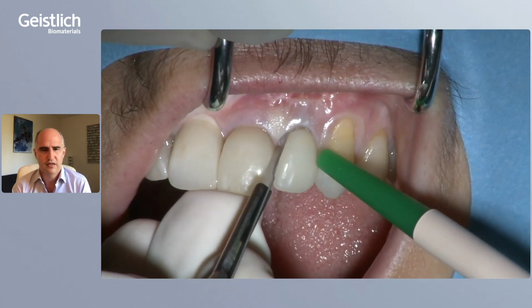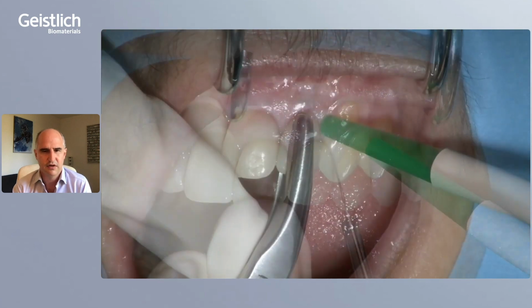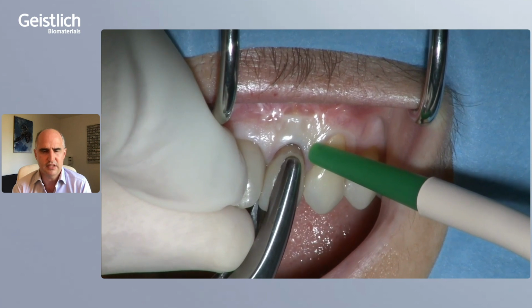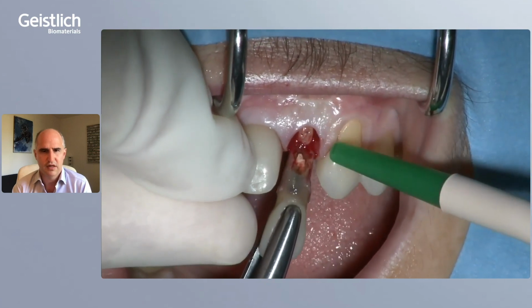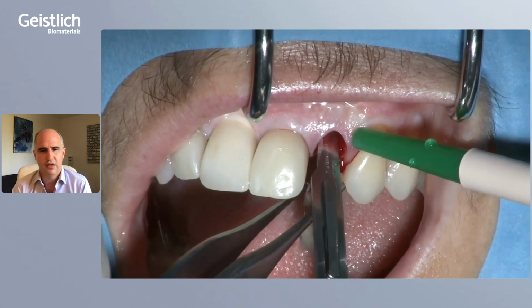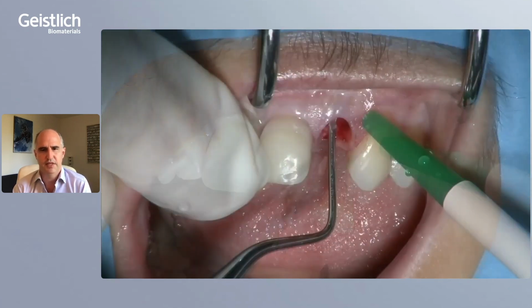So here's the surgery clinical situation of this lateral incisor. Very, very carefully extracting this lateral incisor, as you see it here. It had an endodontic lesion, as you see it here. And what we did is we took away the granulation tissue. We had a dehiscence in this case.